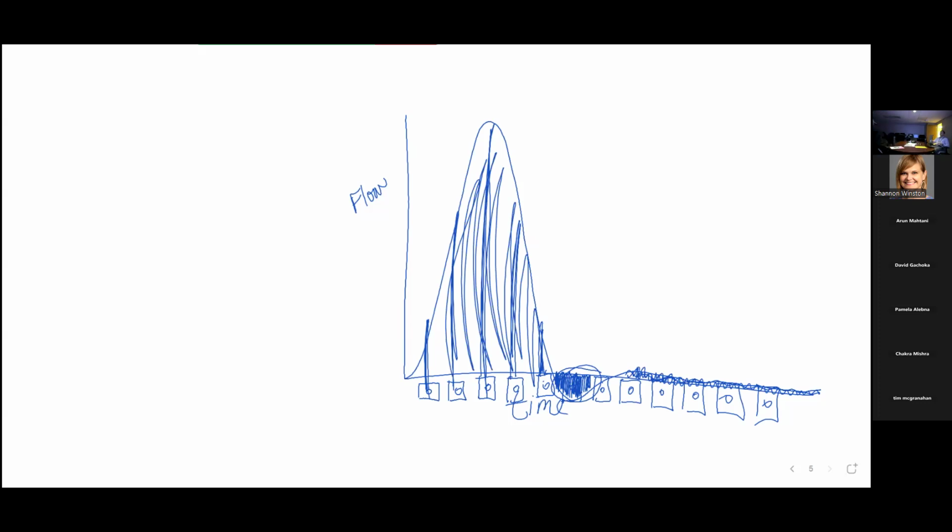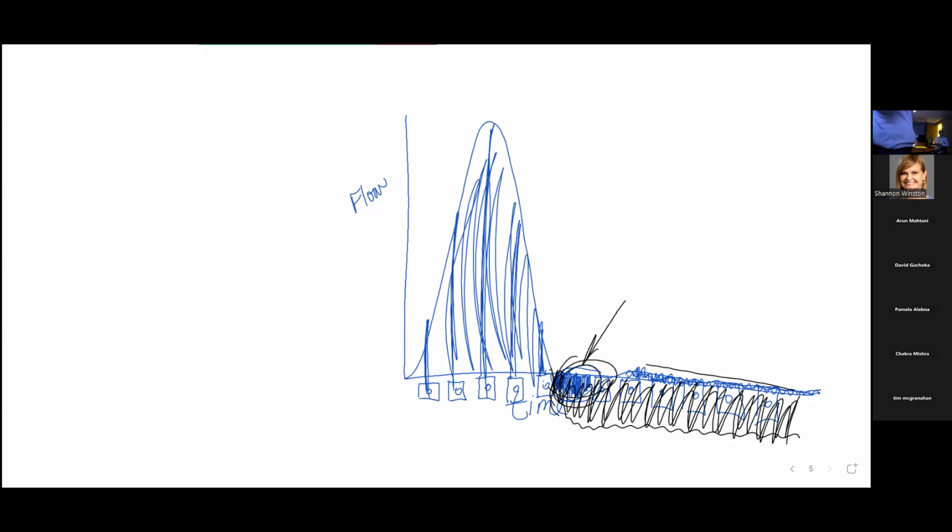So it gets factored into the calculation, but it didn't turn out to be very much. Now, when you have aortic regurgitation, make a new color, make that black. What happens is this flow curve looks like this. And you've got all this flow down here when you have a lot of aortic regurgitation. Okay, so anyway, good question. That's this particular area. It gets factored in, but in the big scheme of things, it doesn't contribute much to the forward flow.